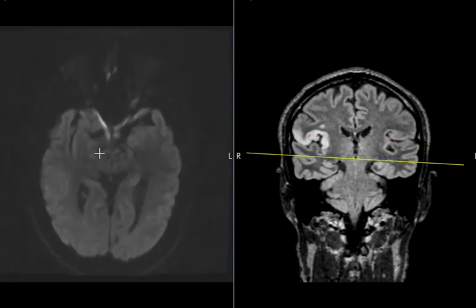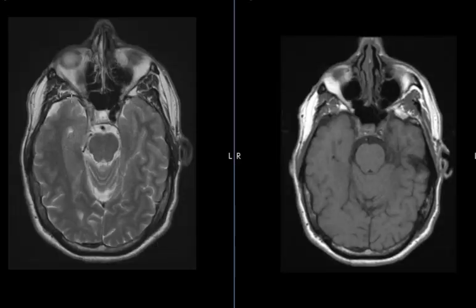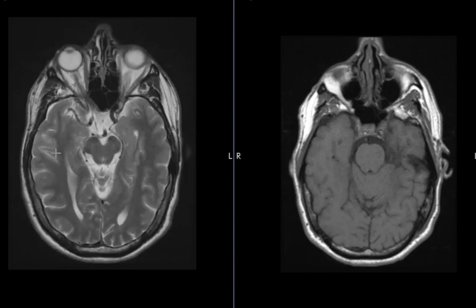We're going to look now at another sequence called a T2-weighted sequence. We see the left internal carotid artery is normal — this is a normal flow void. Flowing blood will look dark on this sequence, and the left ICA or internal carotid artery is open. But look at the right ICA — we don't see the normal flow void, so there is limited or no flow within the right internal carotid artery. The ICA perfuses the right middle cerebral artery, which we've already seen has the infarction.